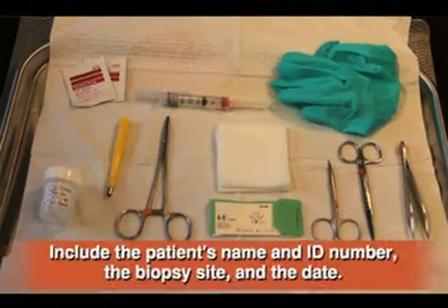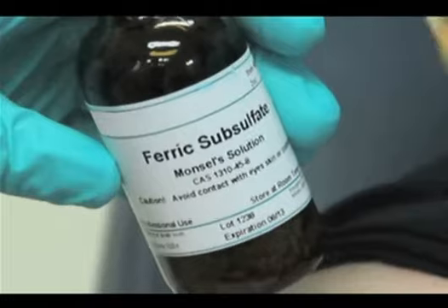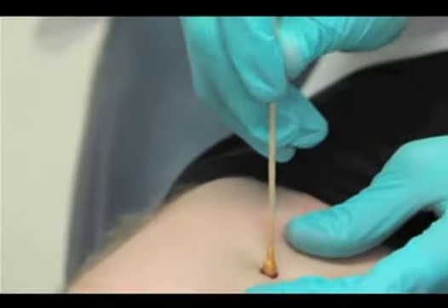Although not shown here to protect the privacy of the patient, the specimen bottle label should include the patient's name, identification number, biopsy site, and the date. For a 2 or 3 millimeter punch biopsy, it is acceptable to use a hemostatic agent such as Monsel's or ferric subsulfate solution alone without suturing the defect.